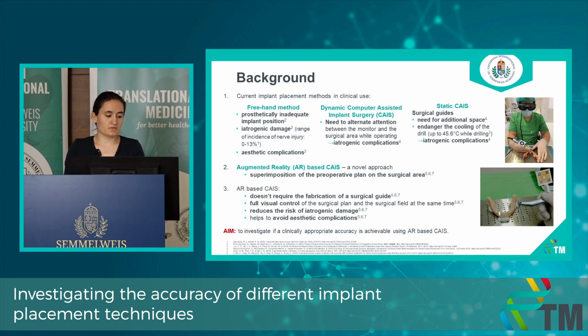So as a solution to all these problems, there is a novel approach called augmented reality-based navigation, which has the potential to eliminate all the mentioned problems. And well, our overall aim is to see if clinically acceptable accuracy could be achieved with this method.